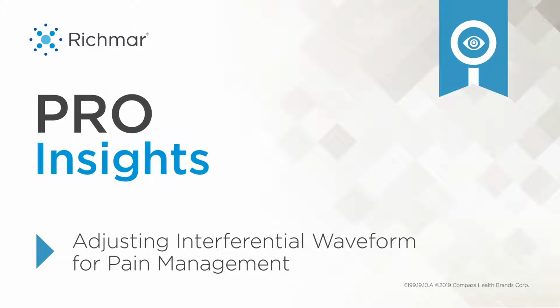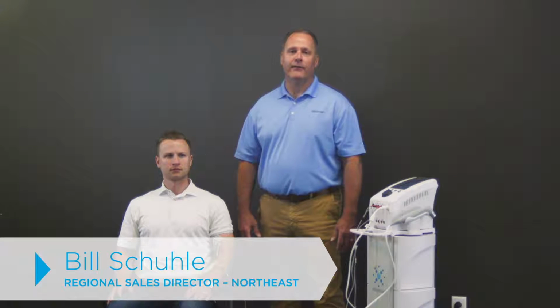As I go around and do in-servicing, I'm often asked by clinicians how to better treat pain with our e-stim devices. Again, it's real simple. One of the most popular waveforms to use for treating pain is interferential. Most devices today have some form of interferential on them. But what most clinicians don't know is there are a lot of parameter changes you can make to make the treatment more effective for both acute and chronic pain.